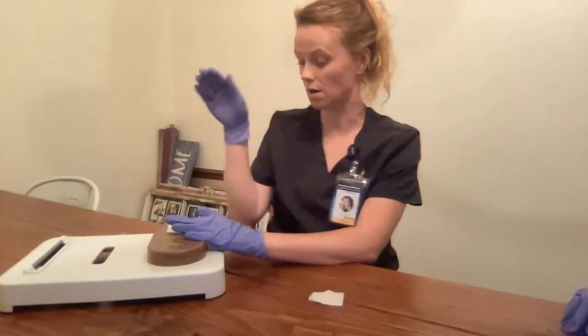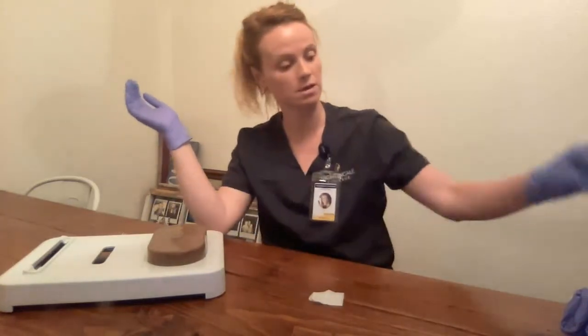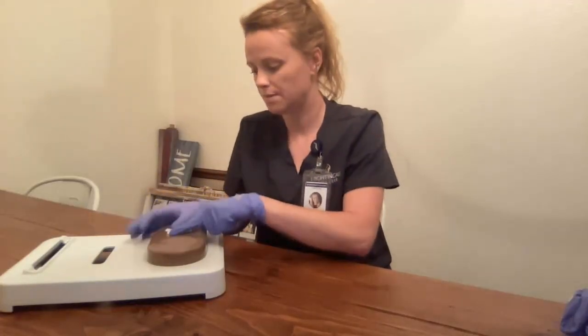I want to hold this for 30 seconds. I've held it for 30 seconds. I want to check for no blood. There is no blood. Dispose of that. I'm going to get a new, clean piece of gauze, put it over the insertion site, and tape it. And I'm all done.